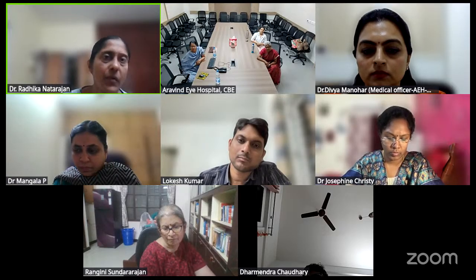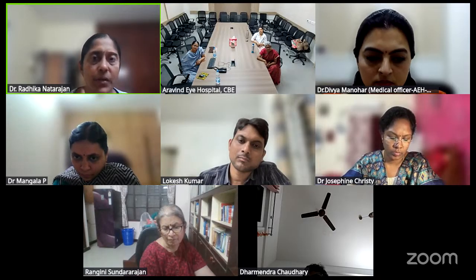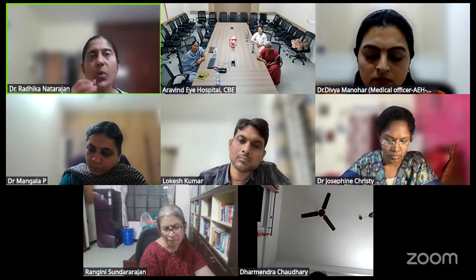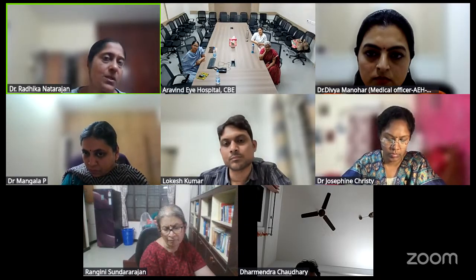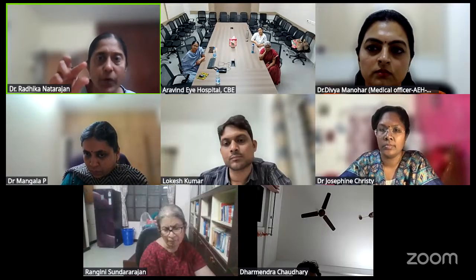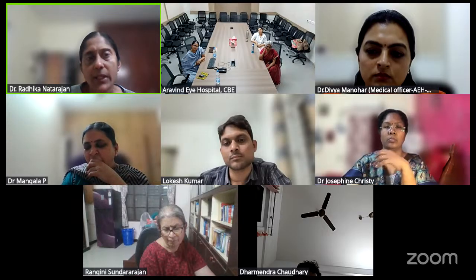But again, every coin has got two sides. So I've always thought that when we cross-link a cornea of adequate thickness because the patient is young or has a risk factor, then the swelling makes the cross-linking too superficial. When the cornea deswells, if you could have cross-linked X amount of cornea, you have cross-linked only X by 2 amount of cornea because you have swollen the cornea unnecessarily before that. So there is a trade-off.